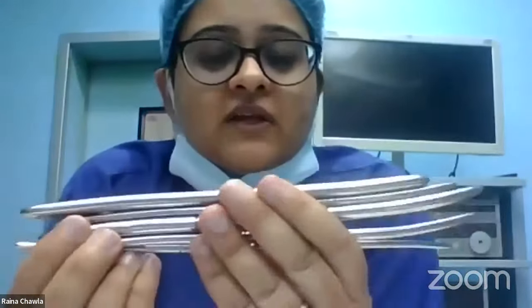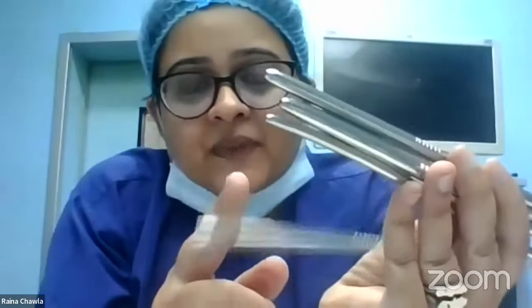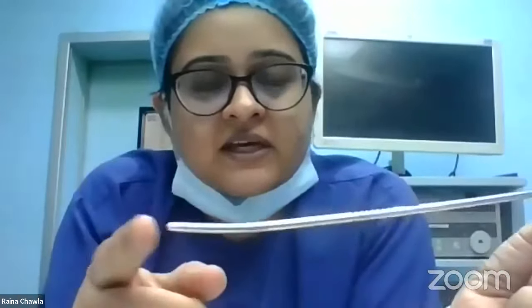The other types of dilators available are Matthew Duncan and Hawkin Ambler dilators. But most OTs and labor rooms will have these dilators. They are numbered according to the diameter of the dilator, and each opposite side is increasing in gradation. So if this is size 1 and 2, then this will be size 3 and 4. The gradation is written here. This is size 4 and 5, then you have this, size 6 and 7. It's increasing, and usually this is the largest dilator.